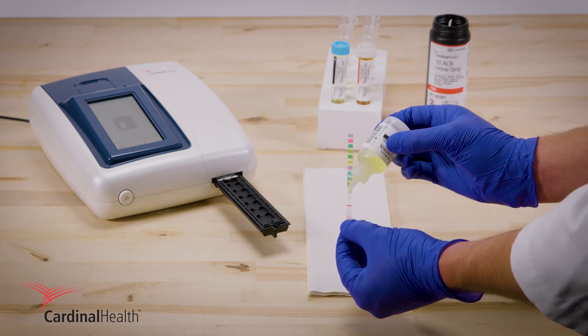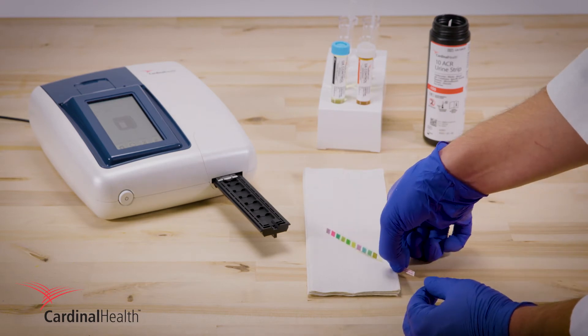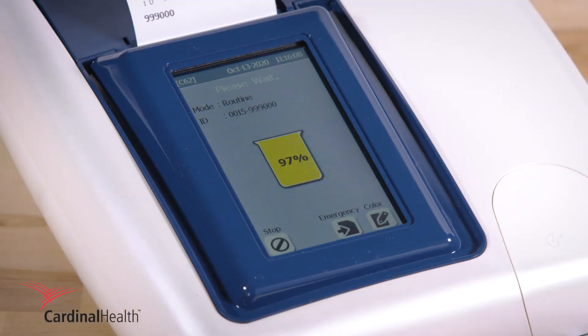If using a dropper, saturate each test pad before tapping on a paper towel. Place the test strip on the strip holder and wait 90 seconds as the on-screen beaker fills.